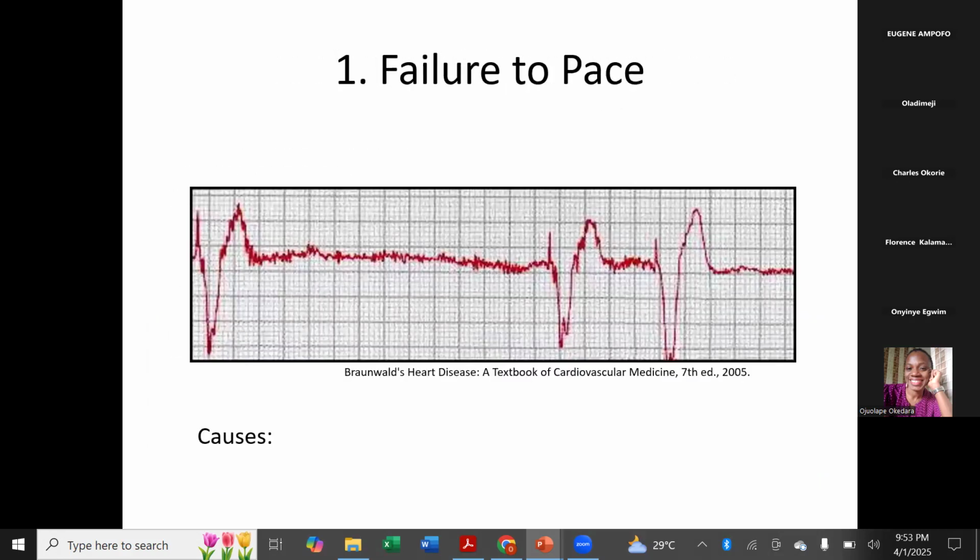So to round up, what are the challenges we can have with pacemakers? So a pacemaker might fail to pace, okay? Remember we gave you an example that some patients are doing activities that can affect their muscle potentials, right? So they can be drilling, and these muscle potentials will be giving artifact like this on the surface ECG, and the pacemaker will be recognizing it as intrinsic activity. Okay? So if it's recognized as intrinsic activity, it will not pace. And that is very dangerous. So look at how long it took for this person to pace. In that kind of case, it didn't pace.